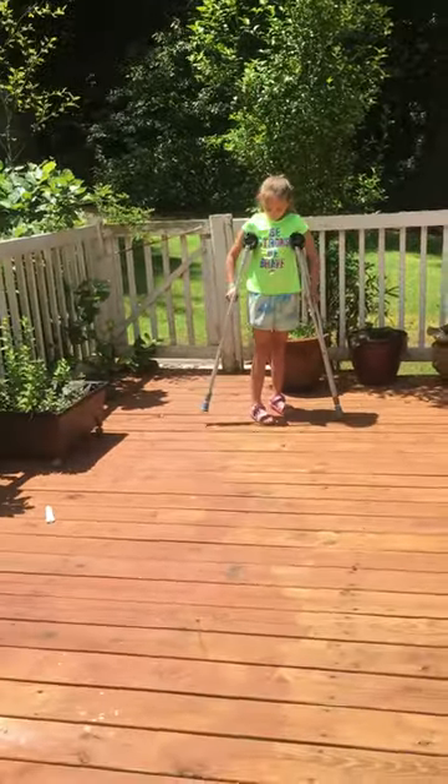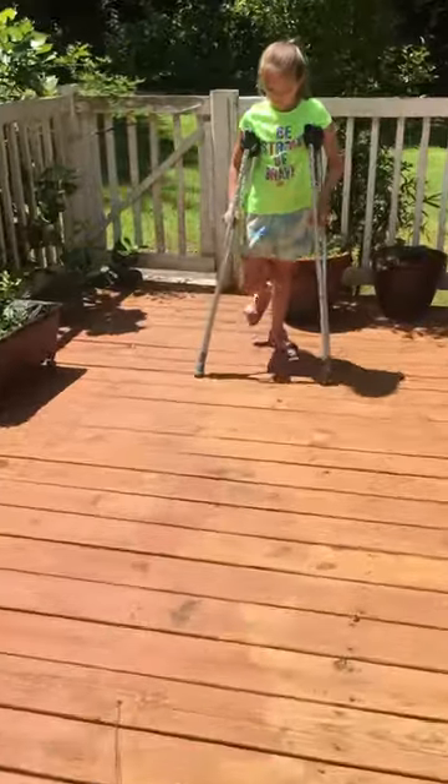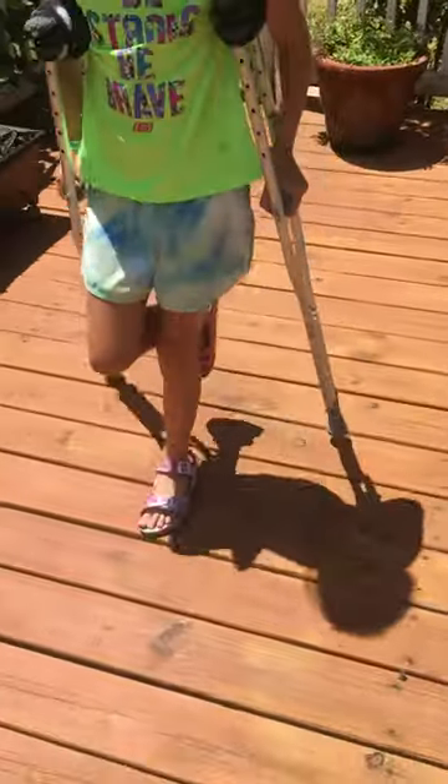So first, we're going to walk forward. Basically, you take the crutch forward and then you hop.